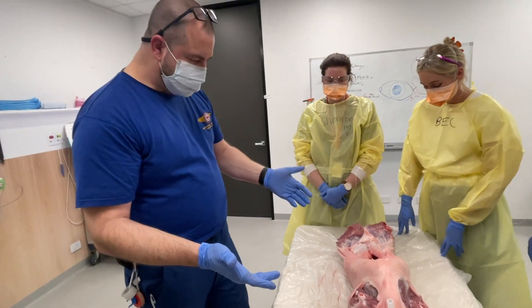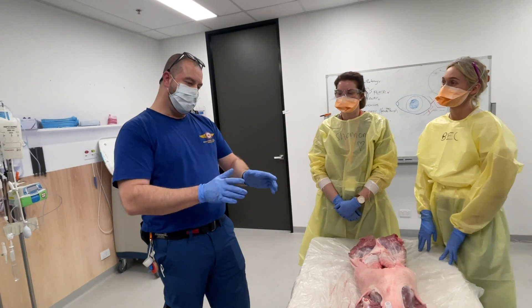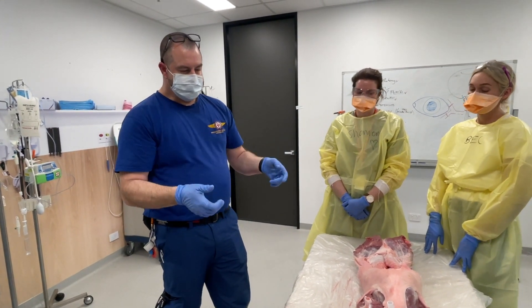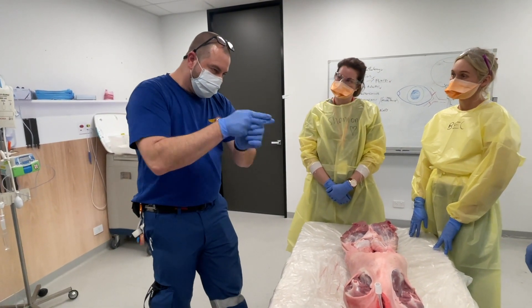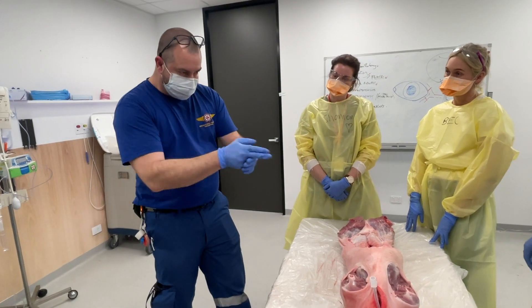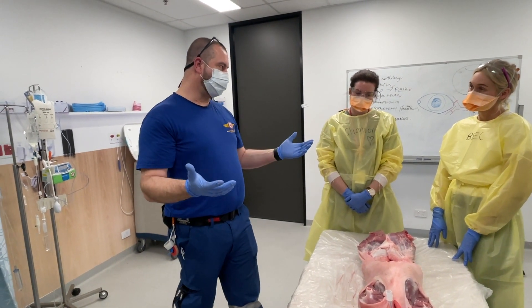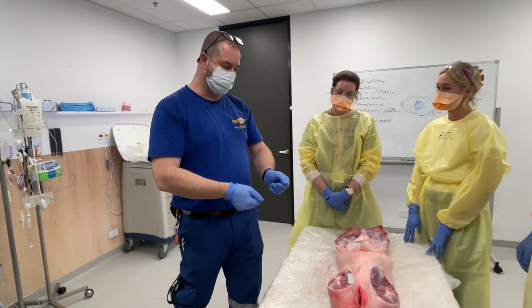We do an instrument-based technique to try and protect the individual from fractures, bone stick injury, and also to assist if the whole chest wall is mobile, like it's a flail chest. It's a little bit more agricultural than the dainty way we learn as junior doctors to do this blunt dissection technique. It's much quicker, but we need to obviously tell people around them what we're doing and why we're doing it, because it can seem a little bit agricultural in the press of doing so.